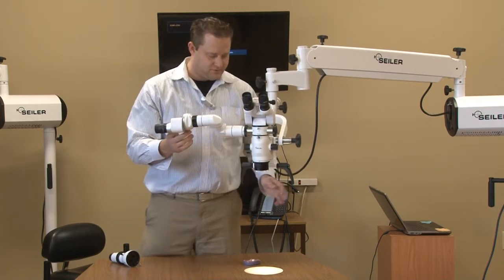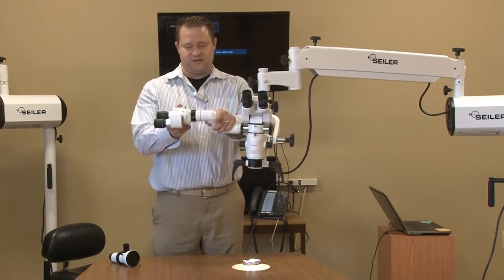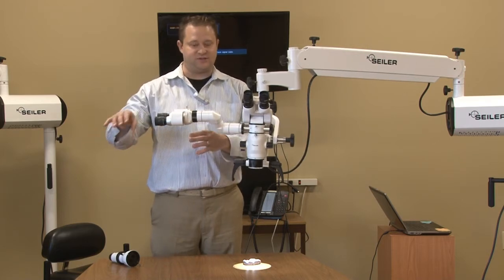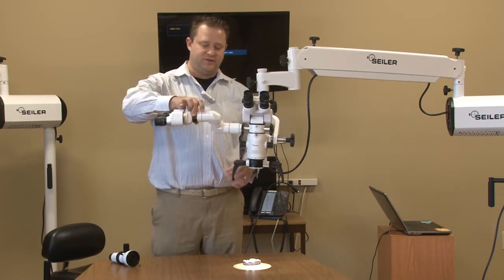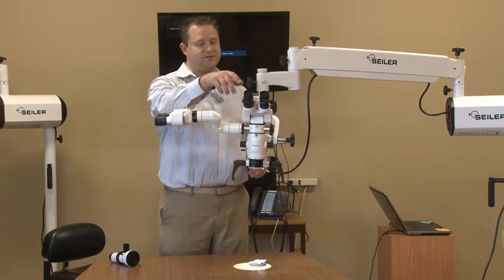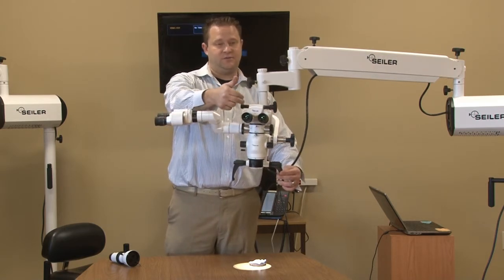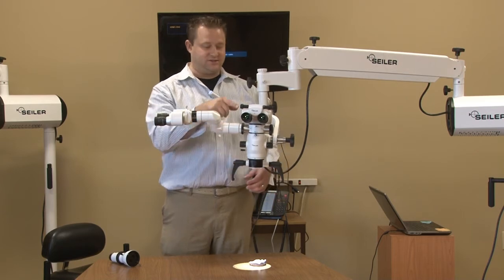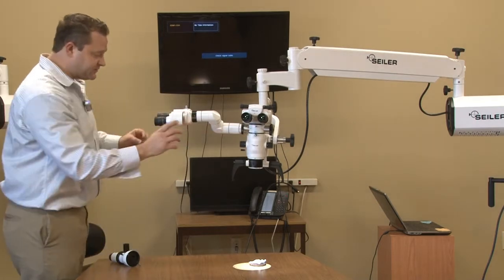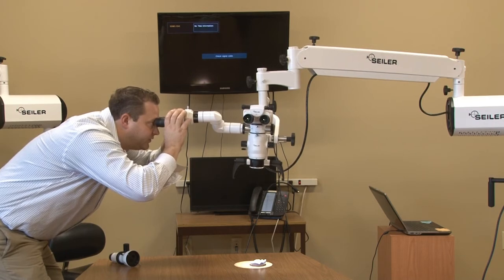You can take the straight head, move it, and have the assistant get in position. This black ring is actually going to rotate the image, so exactly what the surgeon is seeing, the individual can rotate and see exactly what the surgeon is seeing. The doctor is in focus here and the assistant will be in focus here.